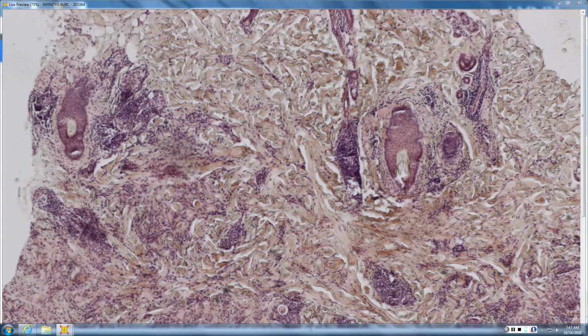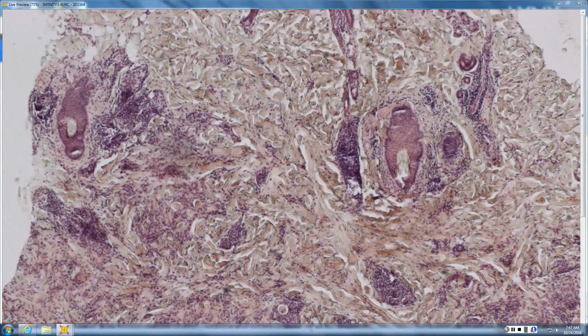The other one that's in that group is PNGD, palisaded neutrophilic and granulomatous dermatitis, which can be variably interstitial, palisaded, and neutrophilic, like the name implies. And that's usually someone with an arthritic condition. They look like smoldering connective tissue disease, and they get these granulomas.